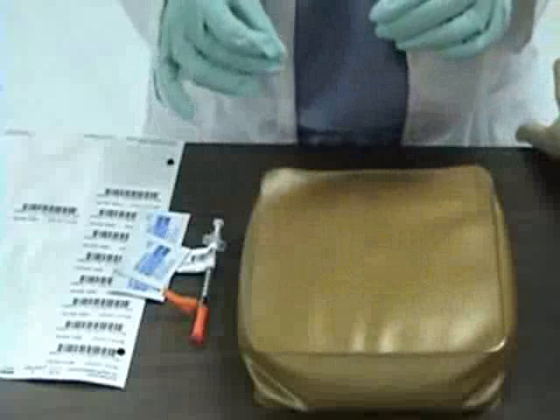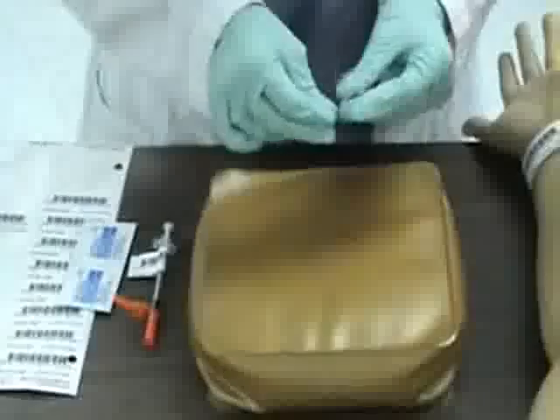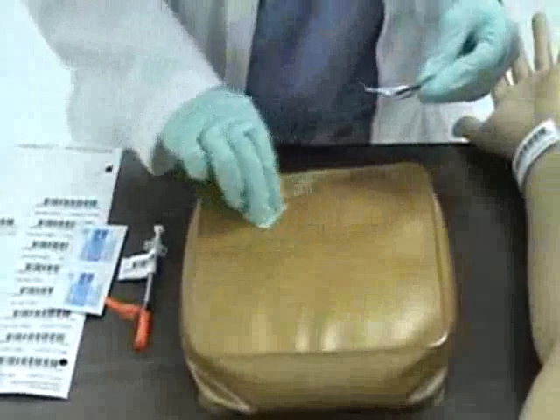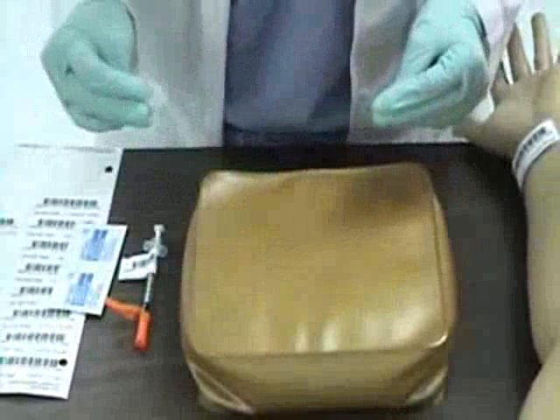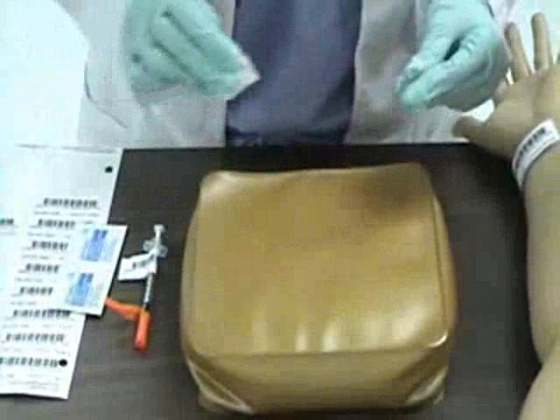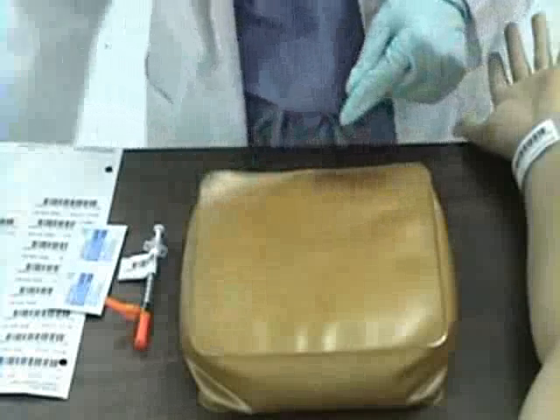I will put my gloves on and cleanse the skin. Today's injection is going to be given in the abdomen. Because I am demonstrating insulin today, it is important for me to note what my patient's blood glucose level is. I will be cleansing the skin with an alcohol prep. It is important to do a skin assessment and make sure that there is no scarring, wound, infection, bruising, anything out of the ordinary at the skin site.